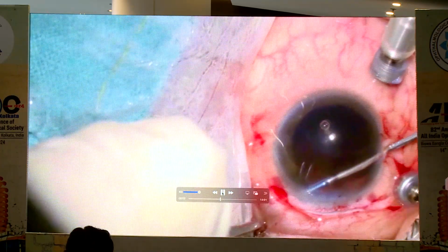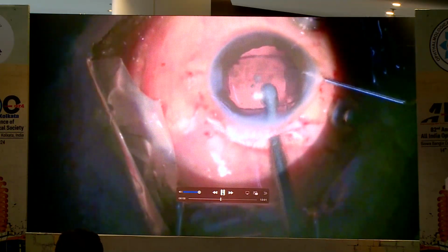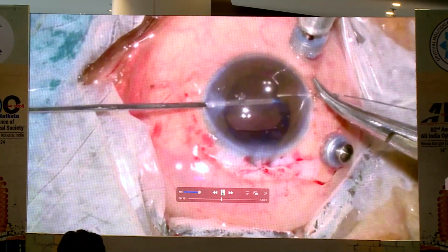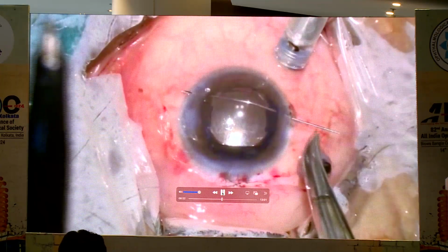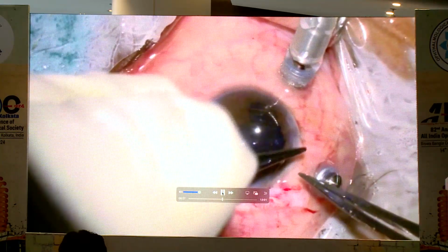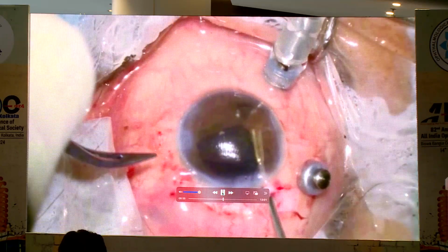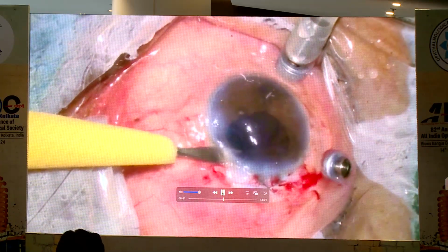So you can see even in this much dilated pupil, because the enclavation takes place in the mid periphery, you can pull it. You can see this kind. And the only trick that has been given is that the incision is given post-limbal and short in length, so you can include the mid periphery rather than enclavate towards the periphery of the iris. And then with another technique, this single pass four-throw pupilloplasty, with the side port, by Dr. Amar Agarwal, there are various methods. This four-throw pupilloplasty was advocated by Dr.